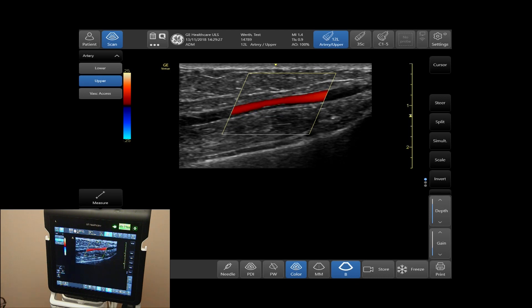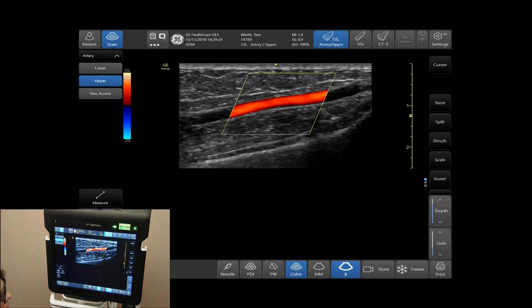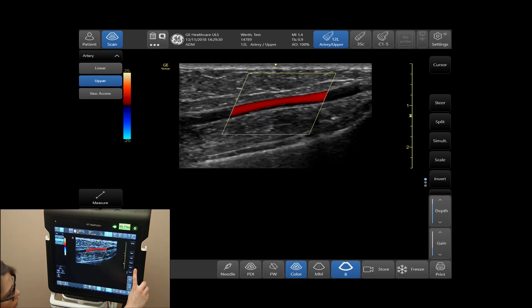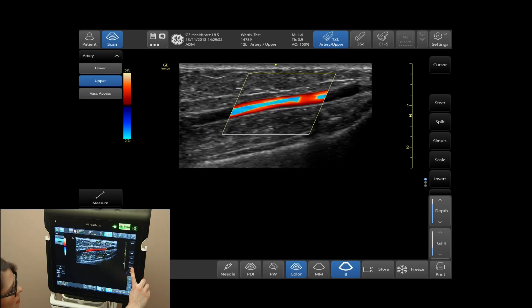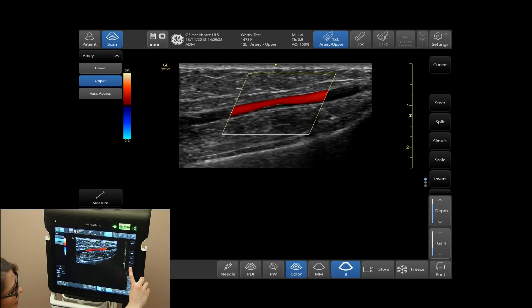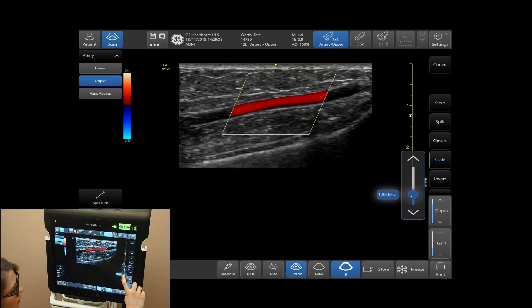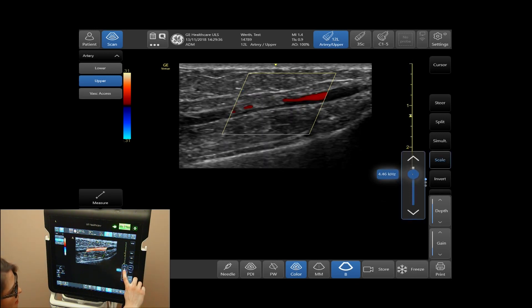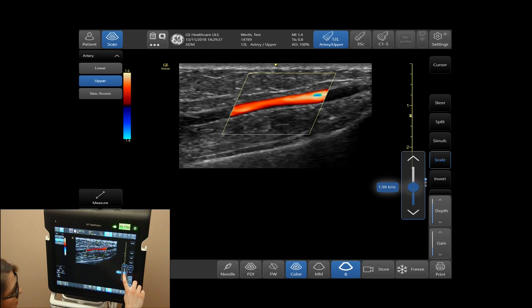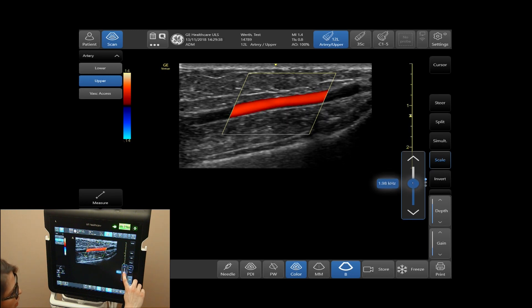To adjust the scale of your color, on the right-hand side of your panel, select Scale and you can increase and decrease from your side panel bar.